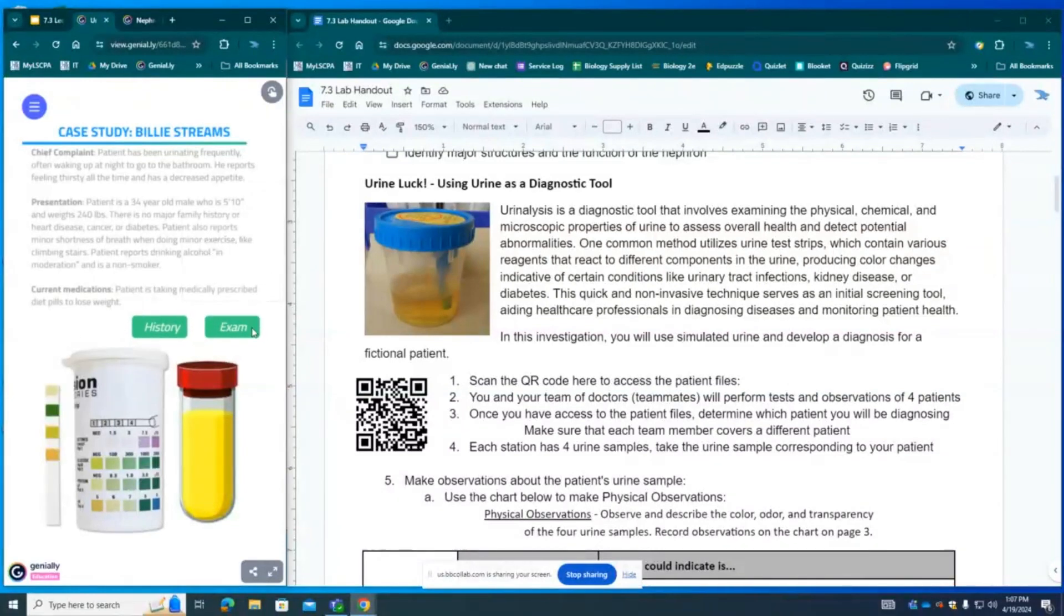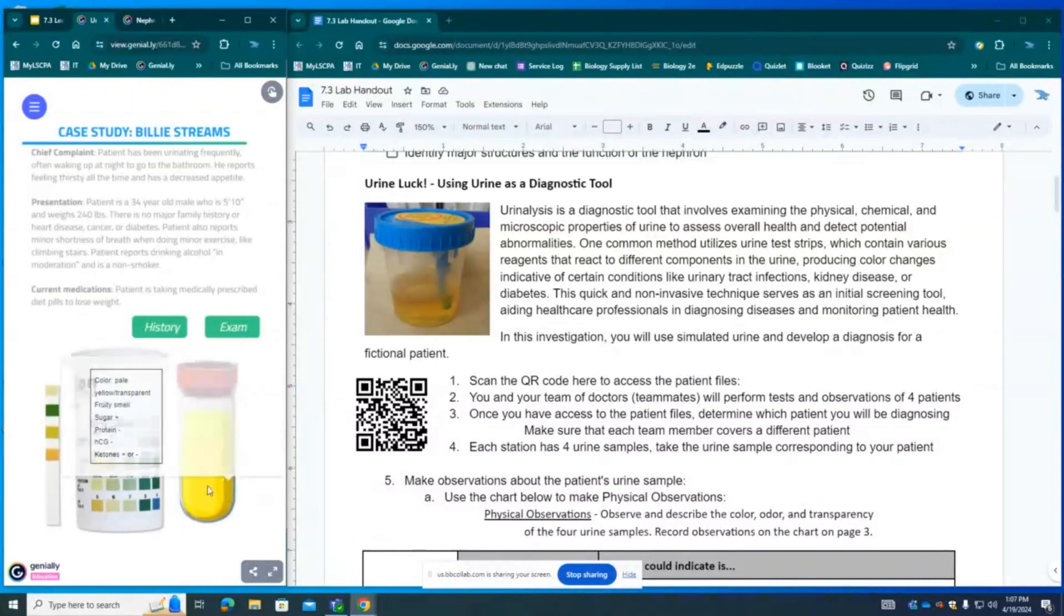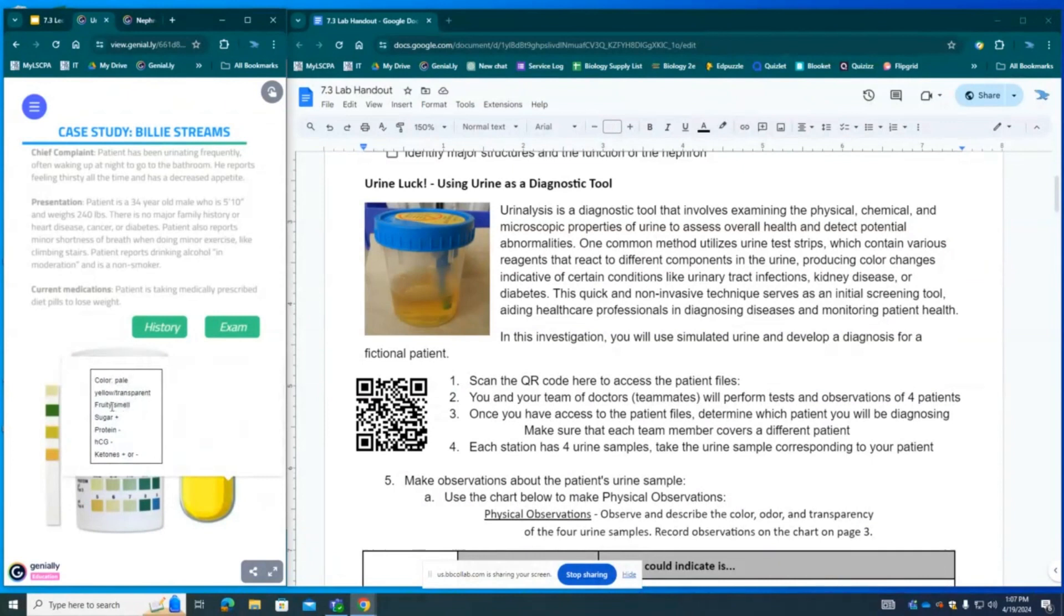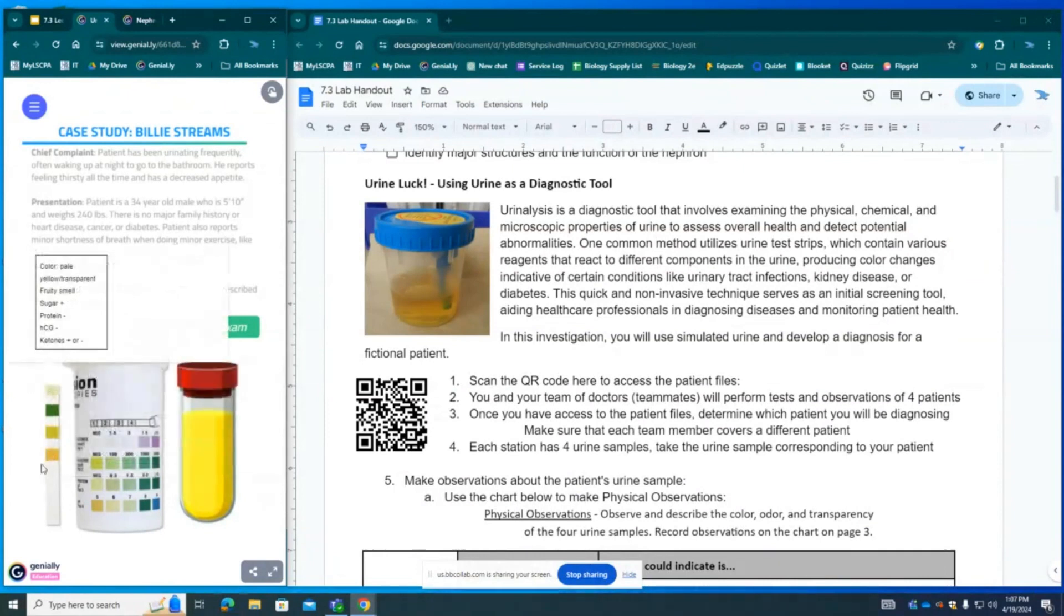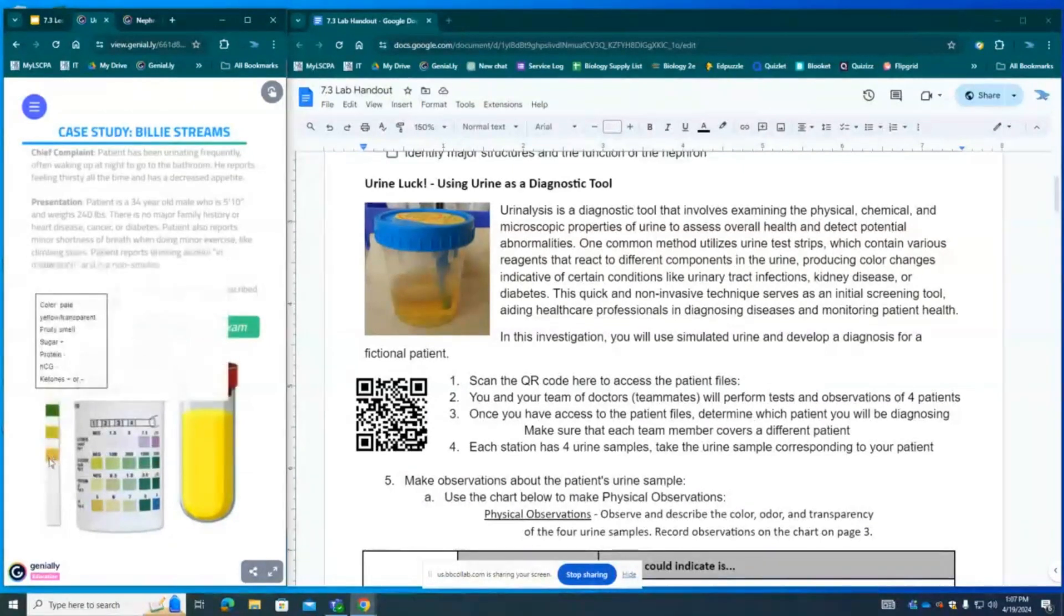So let's look at the urine. Here we have the urine. It is a light yellow color, pale yellow transparent. It has a fruity smell and we can look at this urine test strip.